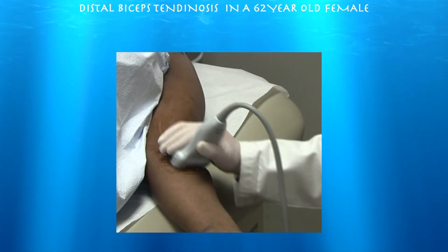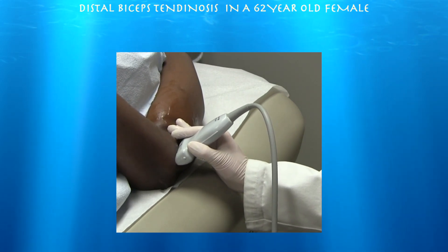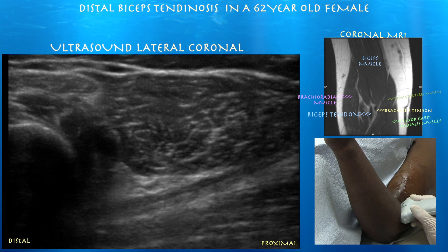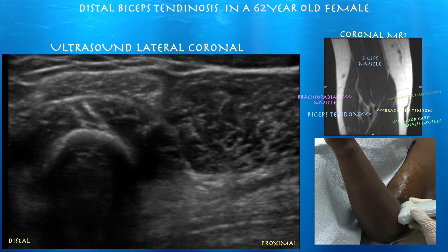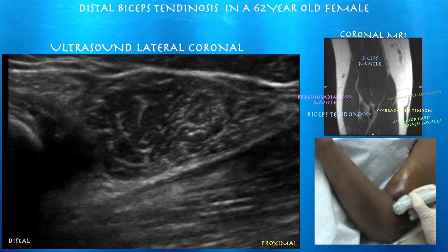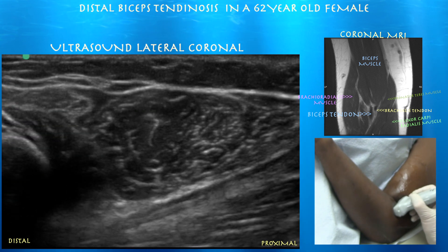Now doing a lateral approach, with the right side of the screen being proximal. I find this approach helpful for looking at the distal aspect of the tendon. Here's the biceps tendon going diagonally across the bottom of the screen onto the radial tuberosity — you can see it heading towards the radial head, with the supinator muscle above that. You can also appreciate the brachioradialis muscle above the biceps tendon, and a nice view of the supinator muscle with the overlying pronator teres.